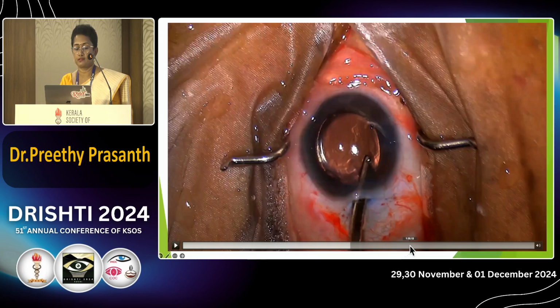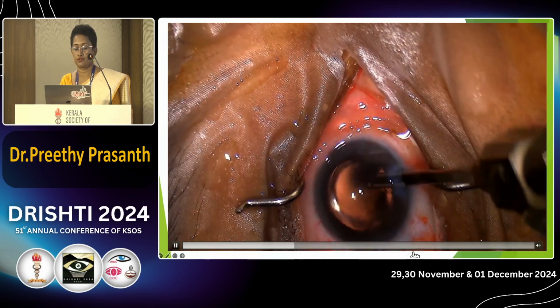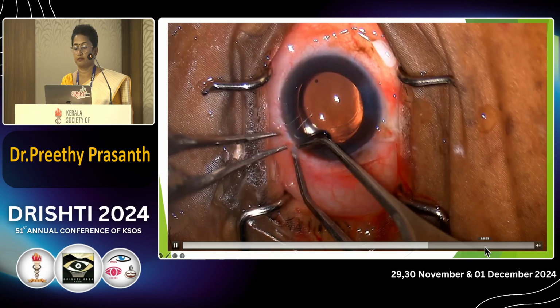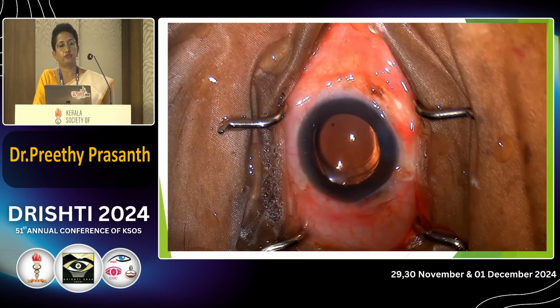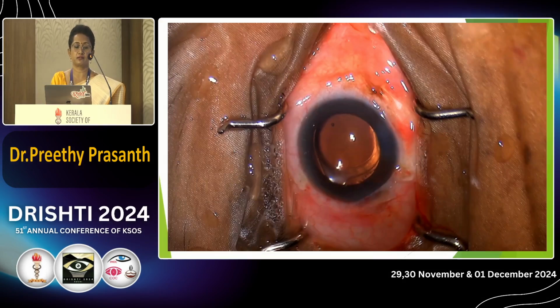Conjunctival peritomy is cauterized. Viscoelastic is washed well. Then you cauterize with wet field cautery, and subconjunctival injection of antibiotics and steroid is given. So as we were talking, before you go for phacoemulsification training, make sure that you learn to do a good tunnel, rhexis in all cases, hydrodissection, as well as in the bag placement of IOL.